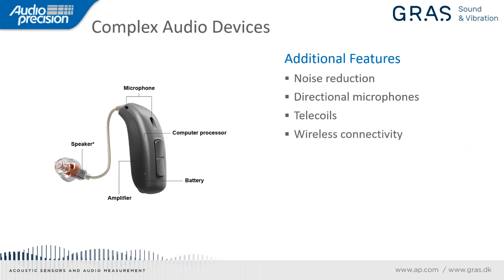Many of them have wireless connectivity. In earlier days, most of the hearing aid manufacturers had their own proprietary Bluetooth protocols for transmitting audio, and now the Bluetooth SIG has come up with a standard for hearing aids that will allow all manufacturers to adopt the same standard, and I think we'll really see Bluetooth take off from there. In addition, they can have remote controls. For example, you can control the programming and the features of the device from a smartphone. Some have direct audio input, a tiny analog input jack that you can connect an external device to, to directly connect the audio to the hearing aid.